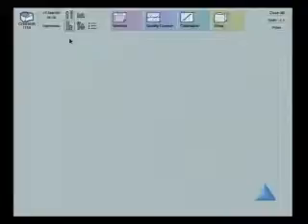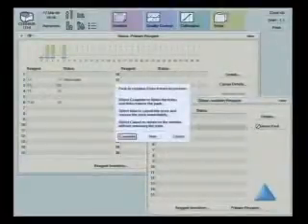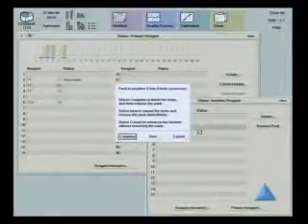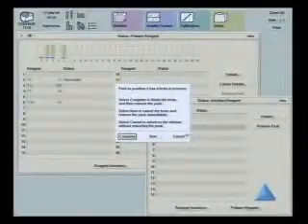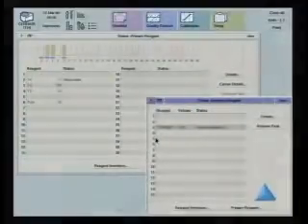To remove an ancillary reagent pack, follow these steps. At the workspace, select the Reagent Status button. Select the Ancillary Reagent button if this window is not already open. Select the ancillary pack and then Remove Pack. If prompted, select Complete or select Now. By selecting Complete, the test scheduled for that pack will be completed before the pack is removed. By selecting Now, the pack will be removed without completing the tests.